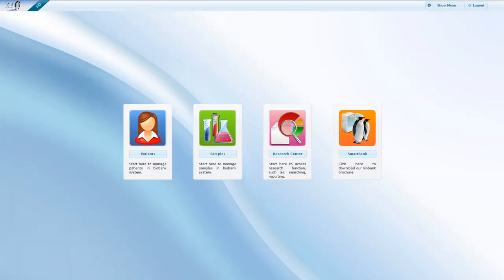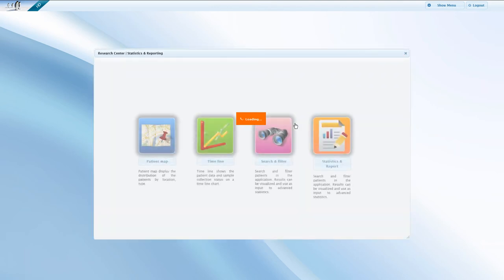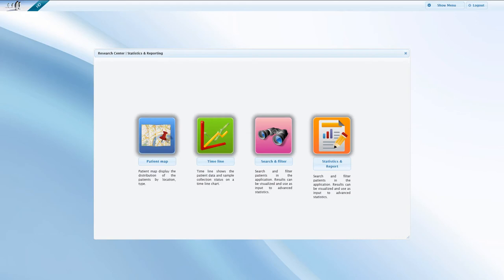After returning to the main menu, let us have a look at the third main module, the Research Center. There are four main tools within the Research Center: Patient Map, Timeline, Search and Filter, Statistics, and Report.